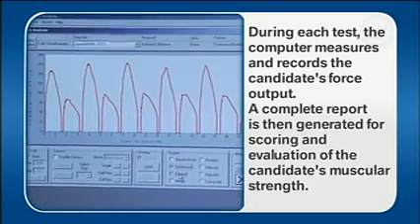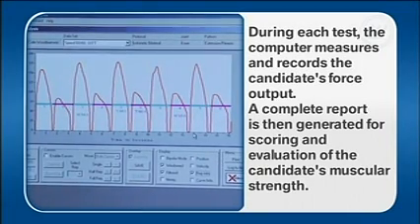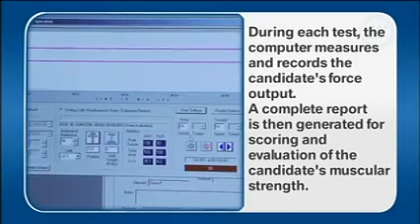During each test, the computer measures and records the candidate's force output. A complete report is then generated for scoring and evaluation of the candidate's muscular strength.